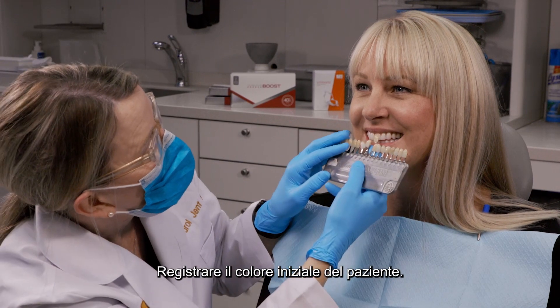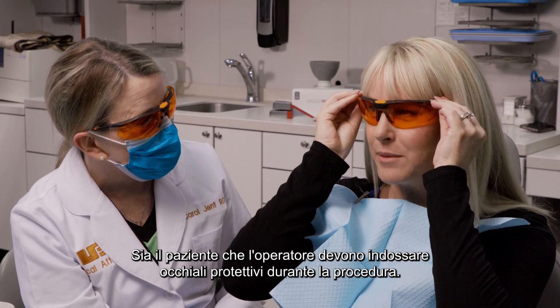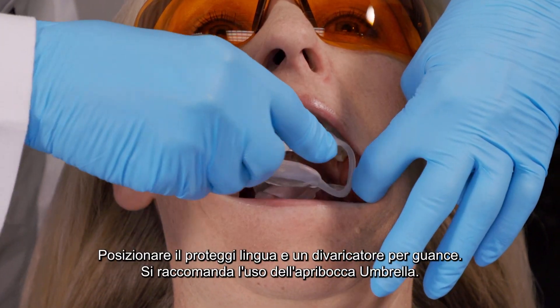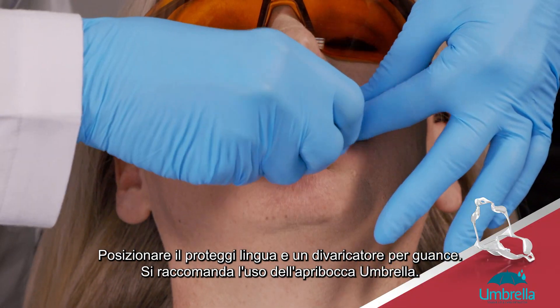Determine the patient's initial shade for your records. Both you and the patient should wear protective eyewear during the procedure. Place a self-supporting lip and cheek retractor. We recommend the Ultradense Umbrella Retractor.